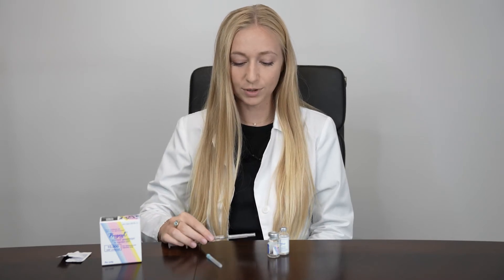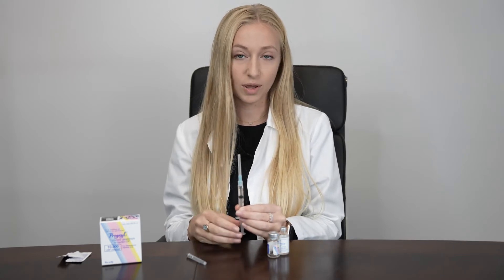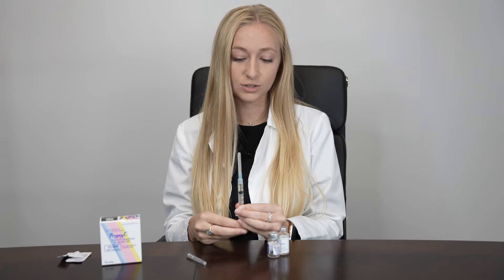Carefully recap your mixing needle and exchange it for your injection needle. This will be a 1.5 inch 25 gauge. Face your syringe upwards and tap to expel air bubbles to the top. Gently press up on your plunger until you see a little bubble of liquid at the top of your needle. That's how you know you don't have any more air in your syringe.